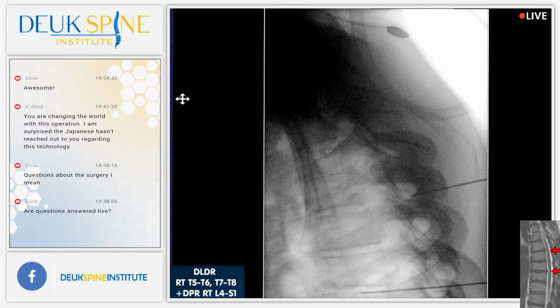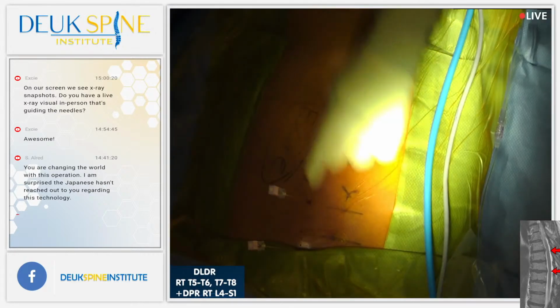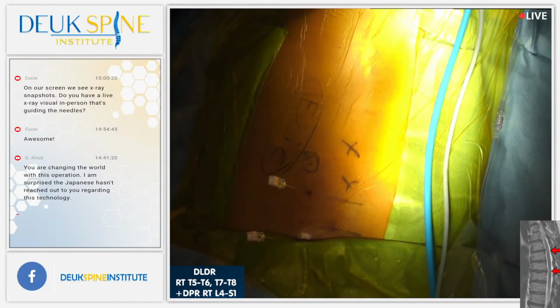Are you awake? Do you get pain up here? Occasionally. Is most of your pain down at the lower one or the upper one? There's two areas we're working on. We'll tap on it for you. You tell us which one. Do you get much pain up here? Occasionally, okay? Most of it's here, right? Yes. So it's the bottom one that's the worst one.